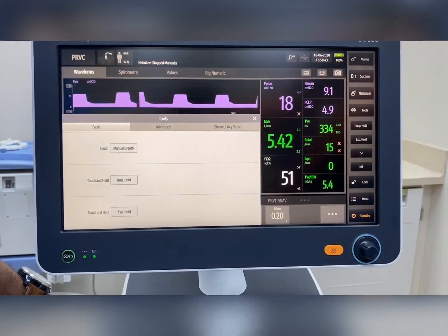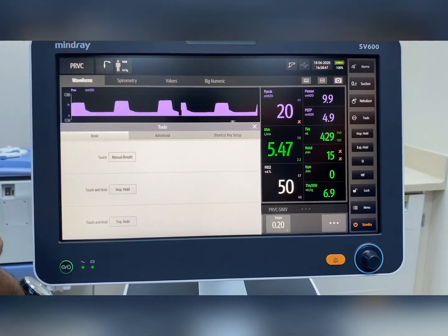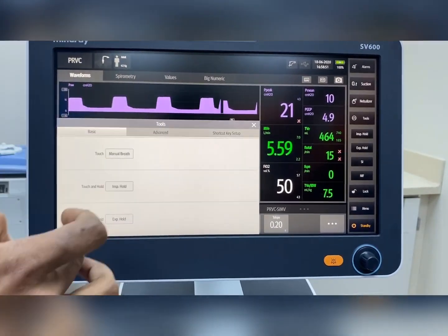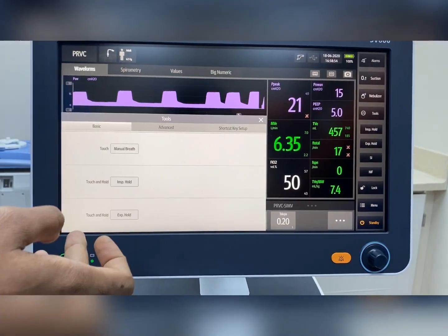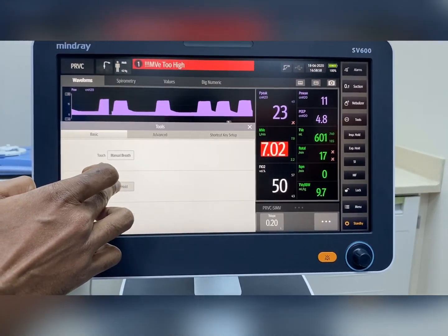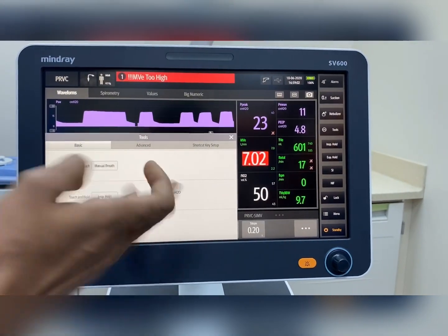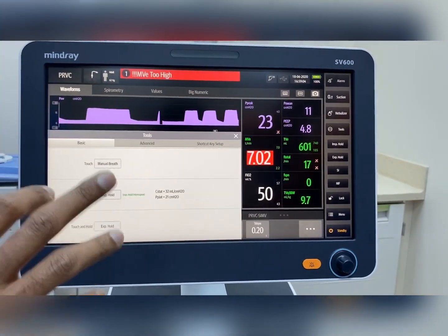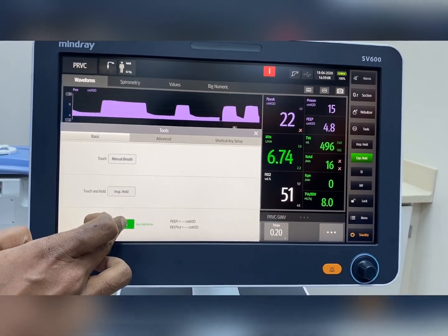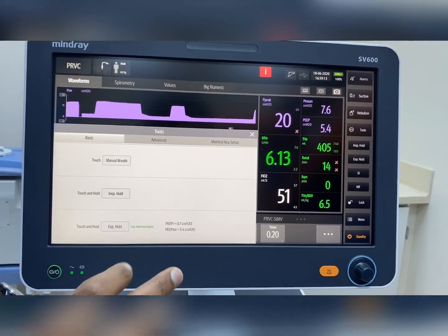There is an option called Tools. In Tools there are three options. If you are doing a procedure and want to give a manual breath to the patient, pressing the option will cause the machine to deliver a breath. Inspiratory hold is available — if we apply inspiratory hold, plateau pressure and static compliance are measured automatically by the machine. Expiratory hold is also available to measure auto-PEEP or intrinsic PEEP, and total PEEP can be measured.